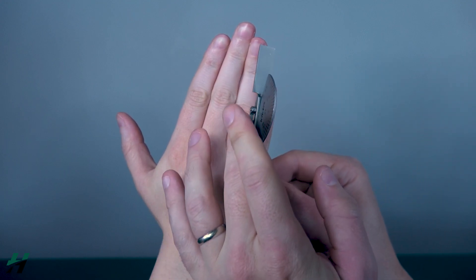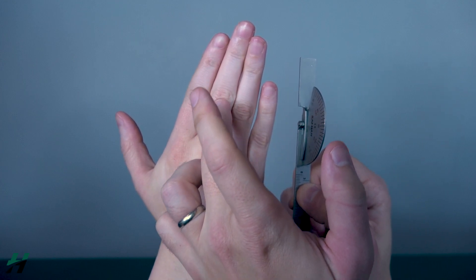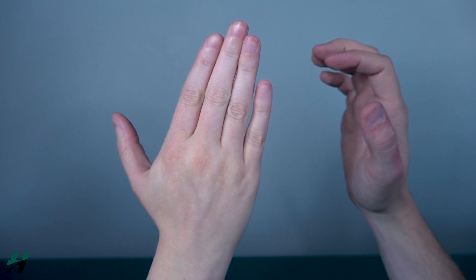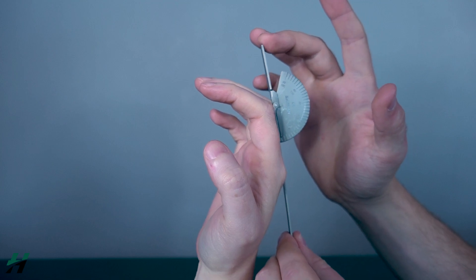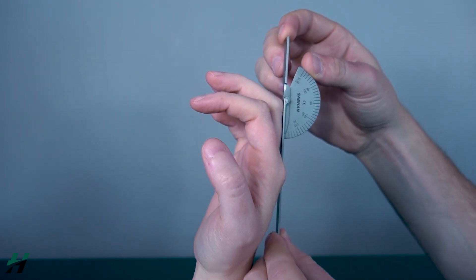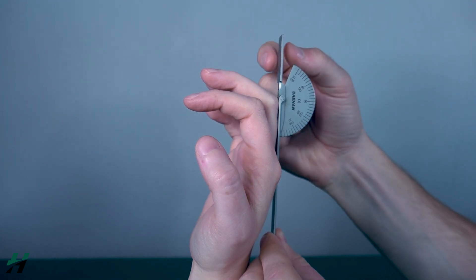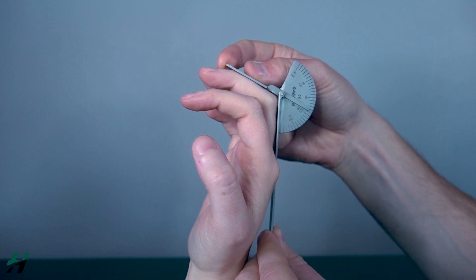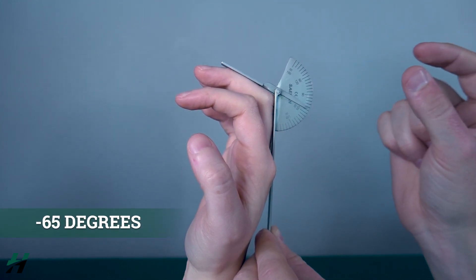When measuring extension it will be identical to measuring PIP and DIP flexion — stationary arm on the proximal phalanx, movement arm on the middle phalanx, and axis on the PIP joint. Rachel, pretend you cannot extend your fingers very far. Normally she should extend to full extension, but we want to see how big this gap is. Bringing down the movement arm, we're looking at 65 degrees lacking in extension, so we would call that negative 65 degrees of extension.